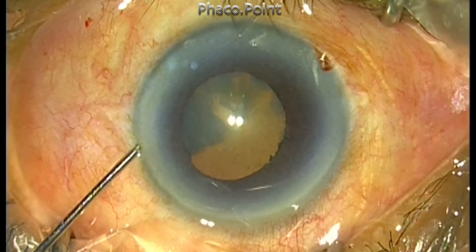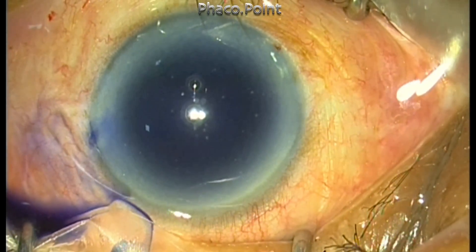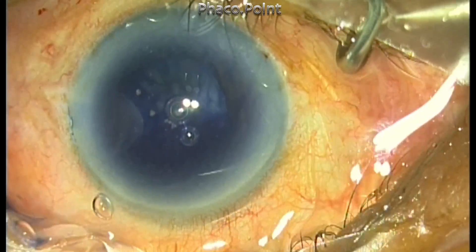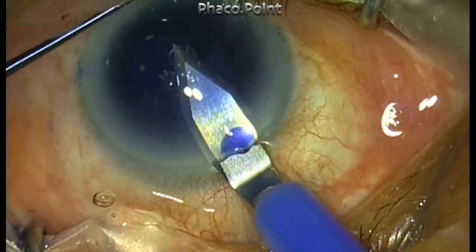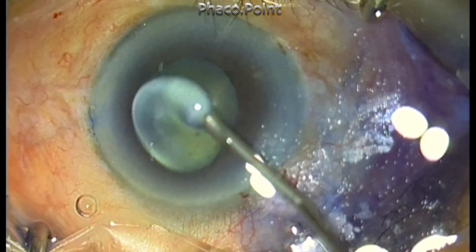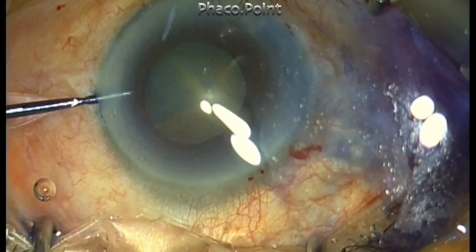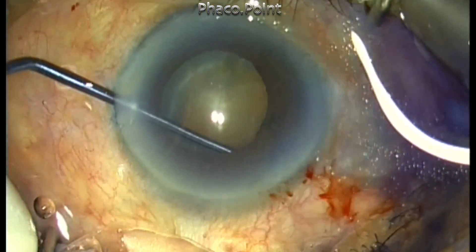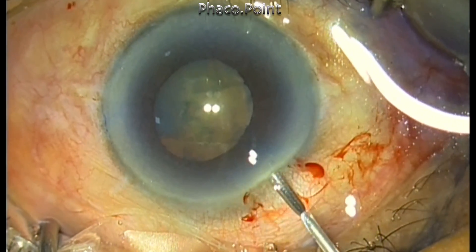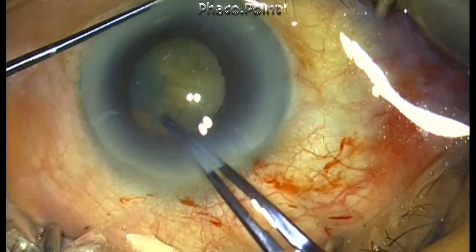The second case is slightly more challenging. The patient had a 4.5 mm pupil with narrow angle glaucoma for which laser peripheral iridotomy had been performed in both eyes. There was a small area of posterior synechiae at the 11 o'clock position. A peribulbar block was preferred over topical anesthesia. Intracameral trypan blue is used to stain the anterior capsule, then washed off before the capsulorhexis. A rod is used to break the small area of posterior synechiae, after which capsulorhexis is performed — aiming for as large an opening as possible, with a pupil-hugging capsulorhexis highly indicated in such cases.